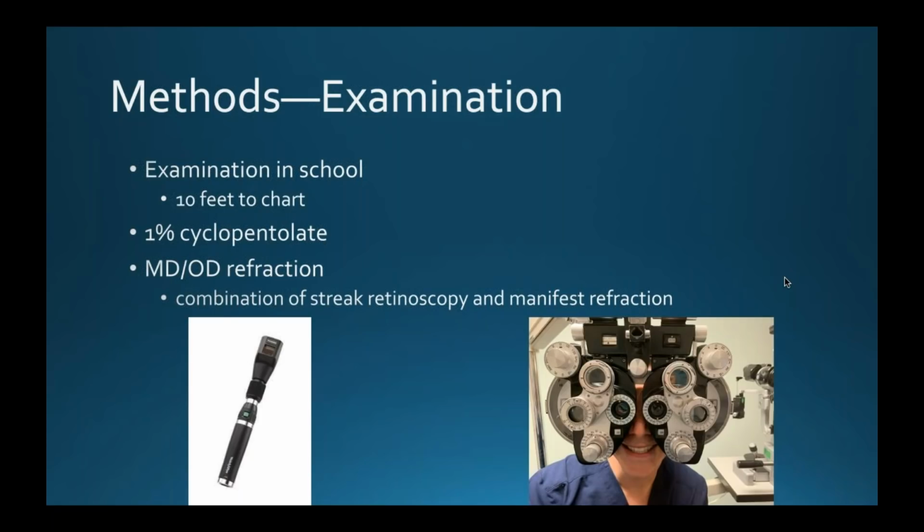But we also can do a manifest refraction using what's called a phoropter, which you may be familiar with, which is better, 1 or 2? One of your favorite questions. But children can participate in this examination pretty reliably to understand whether or not they need glasses.